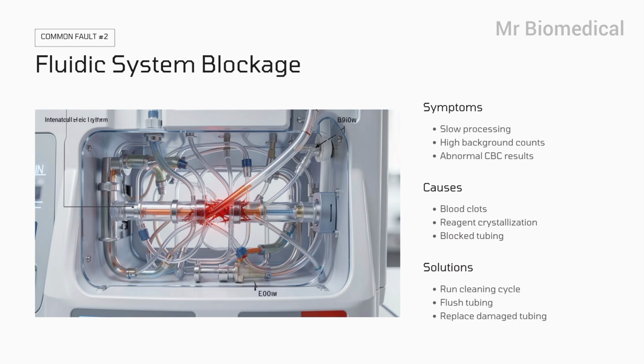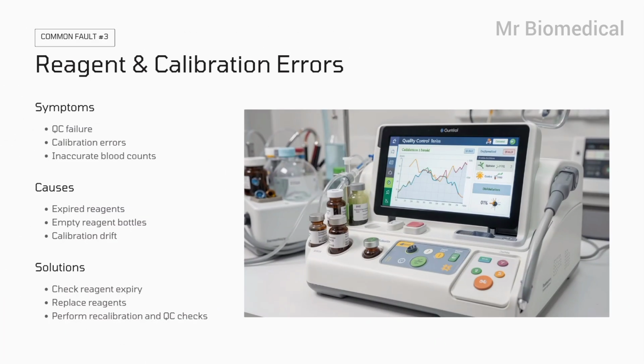The first troubleshooting step is running the instrument's cleaning cycle. If the issue persists even after cleaning, flush the tubing and inspect for damaged sections that may need replacement. Regular cleaning significantly reduces problems and improves the analyzer's reliability.